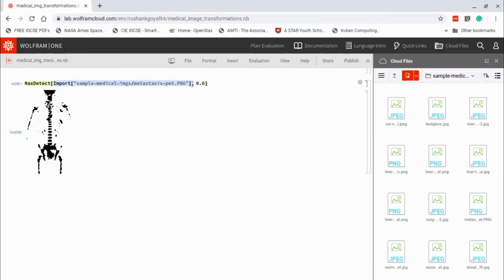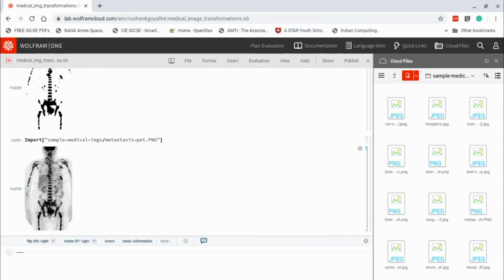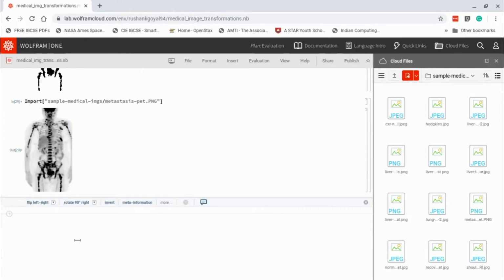So as an example, if I were to show you just this image, you really wouldn't be able to tell is it normal, is it abnormal. I mean, you could, but not an AI algorithm, because each person has a different heart size and a different body shape, and those are factors that we know don't really influence the diagnosis, but an AI algorithm doesn't know that, and so it has to be trained that way.